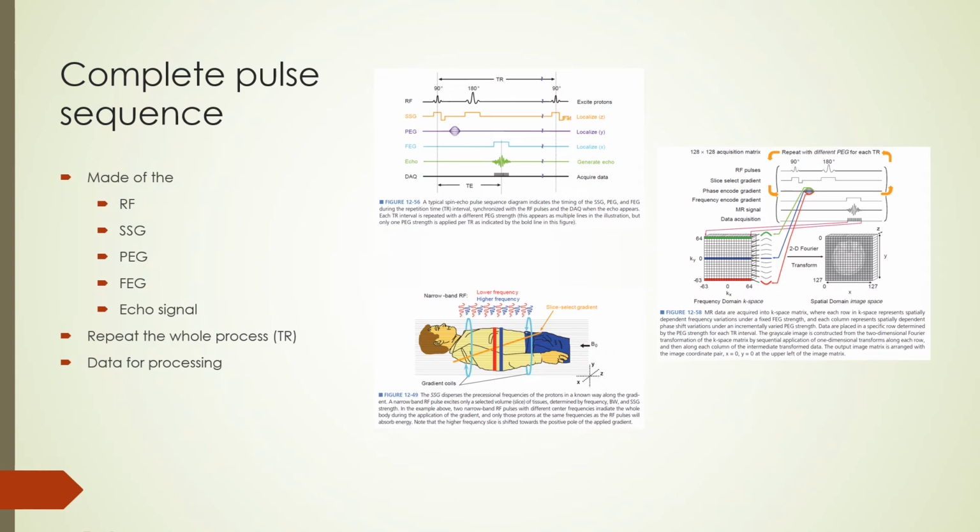This is one signal. This process can be repeated up to 4 times and the signals averaged. If the process is repeated 4 times, we have 4 signal averages. The next phase encode gradient row is selected and 256 frequency encode gradient columns applied and several signals averaged.